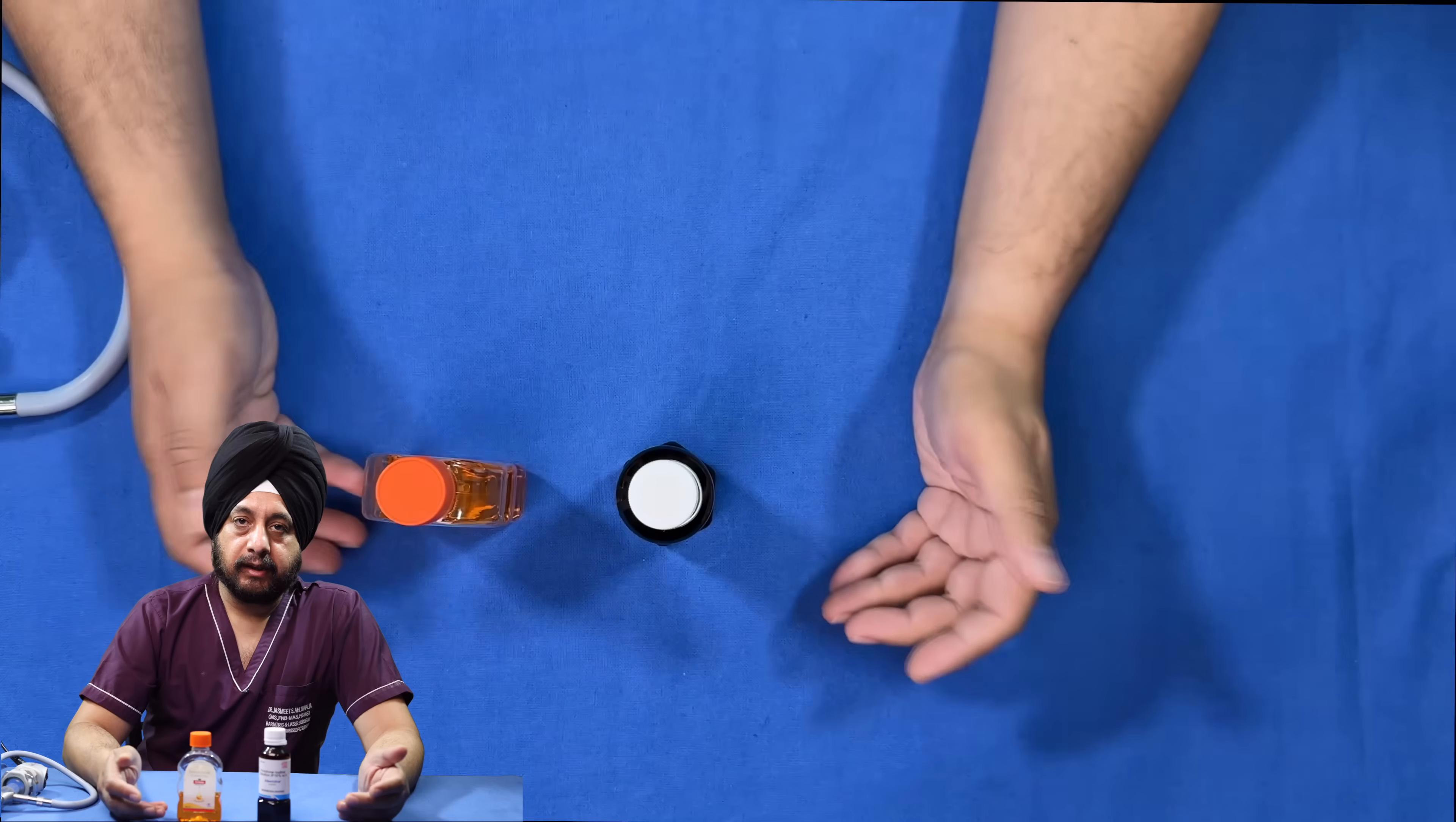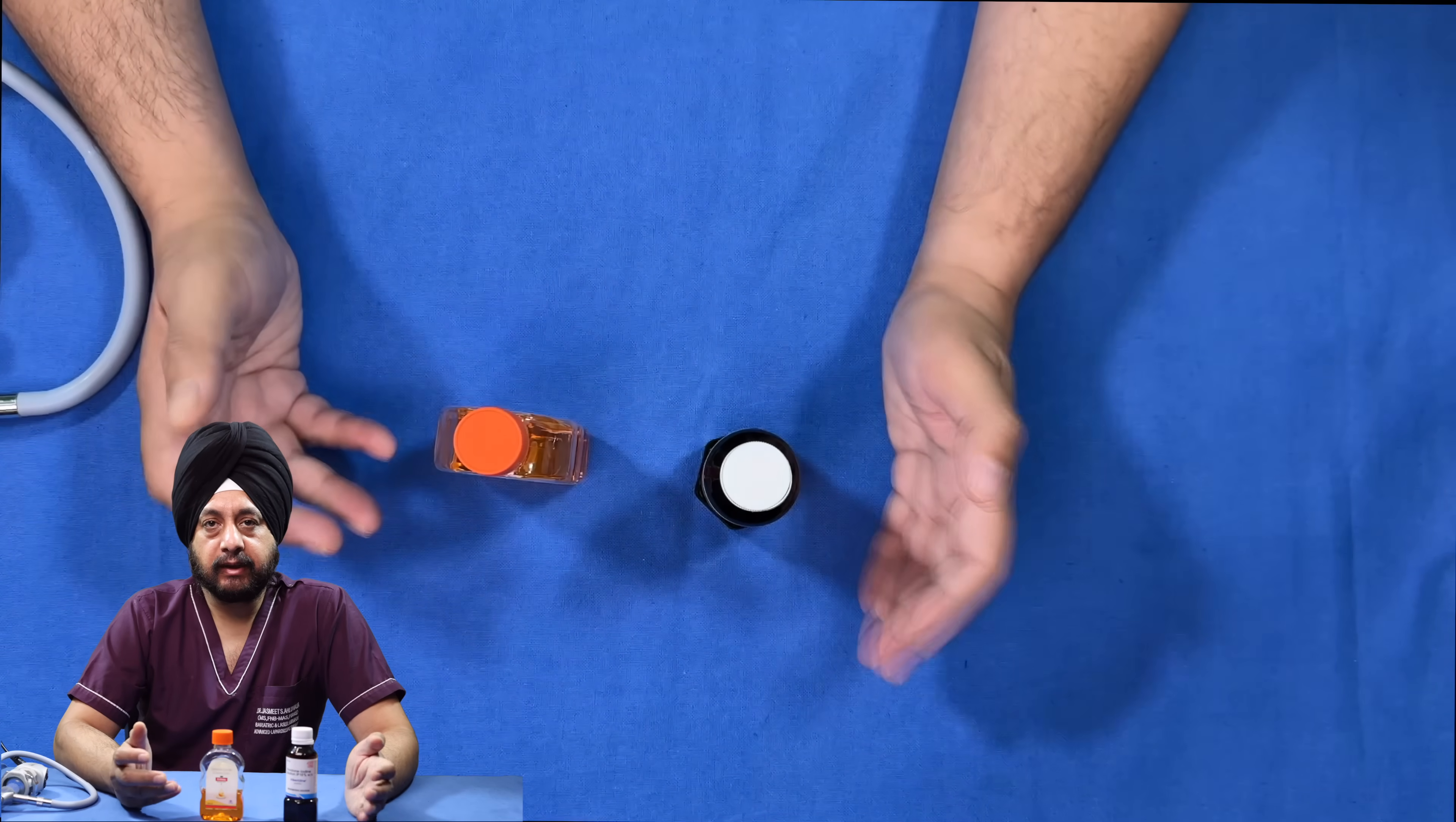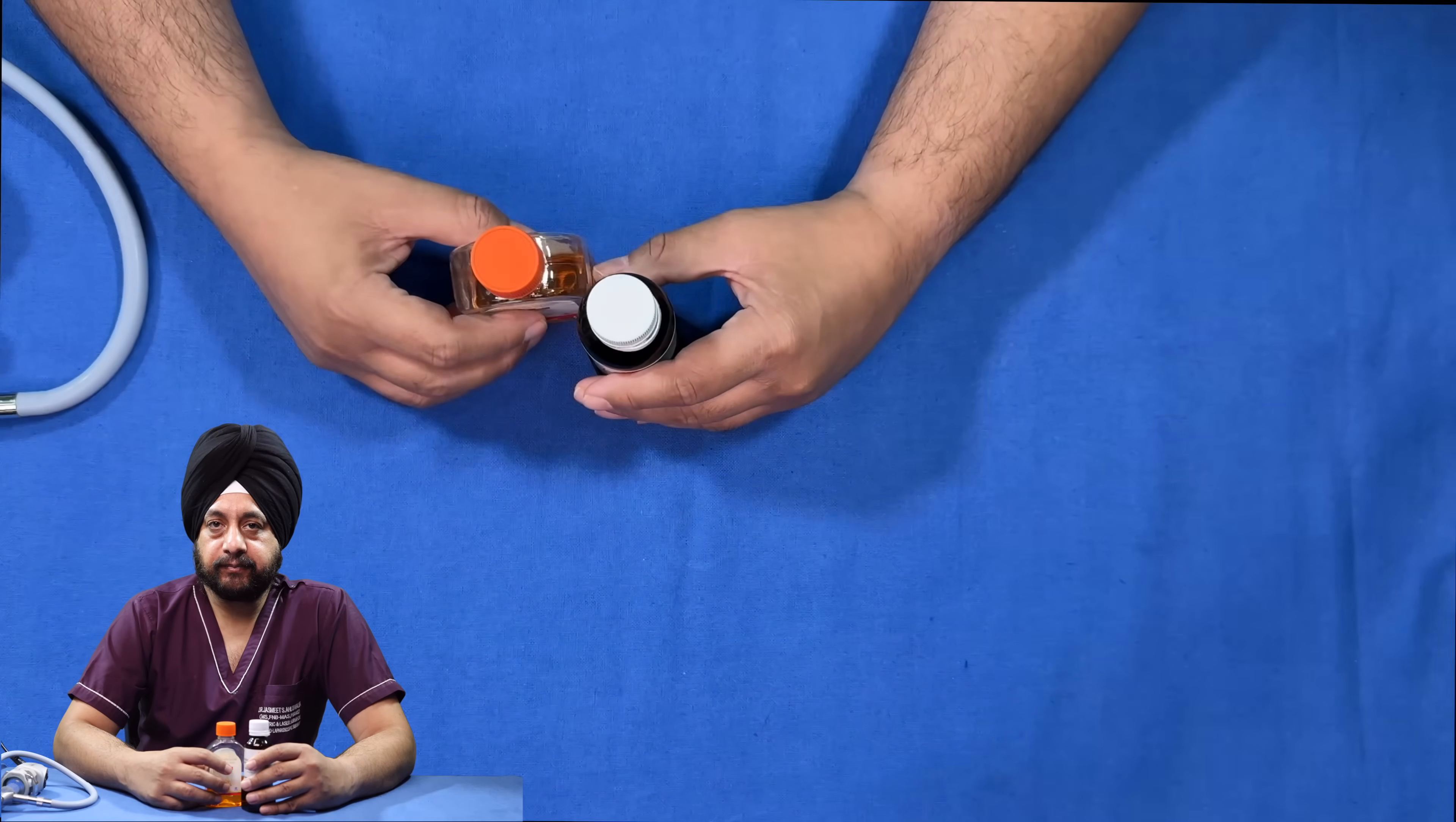Apart from that, you can use Savlon or povidone iodine. Just wet your pad and with a gentle swipe, you can make the tip of your scope wet. First clean it, then just make it a little wet so it does not fog when you go inside. There are also certain anti-fog solutions available with various manufacturers which can be used. Thank you.